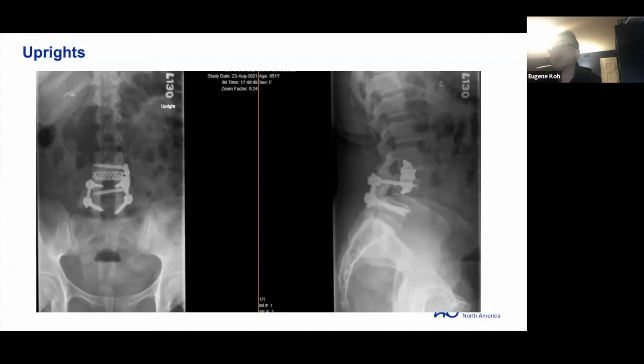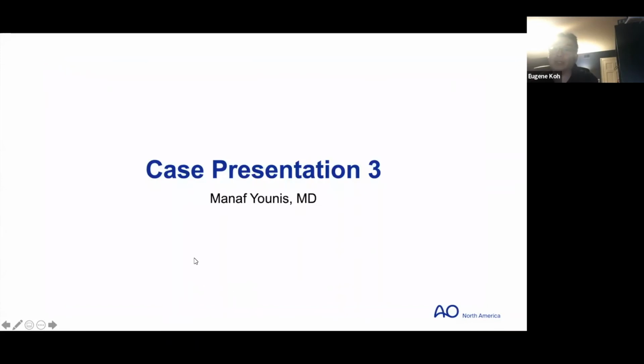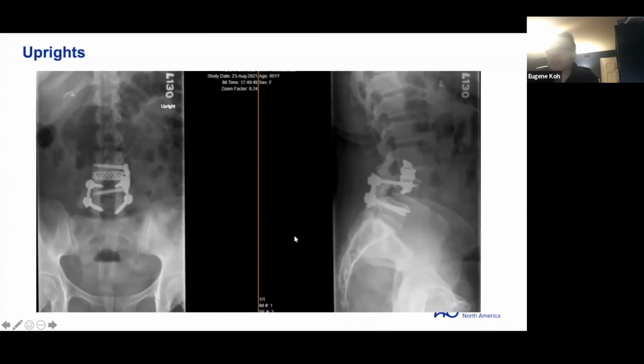Great question about osteoporosis. If it is osteoporosis, I probably would do a cage and then back it up posteriorly. I don't necessarily trust the standalone cages. I think you can get some subsidence. I also get concerned about doing a cage and a plate in osteoporotic bone. One of the questions that got brought up in our question and answer session is, do we consider a cage and lateral plate equivalent to a cage with pedicle screws? What's the comment and thought about that?